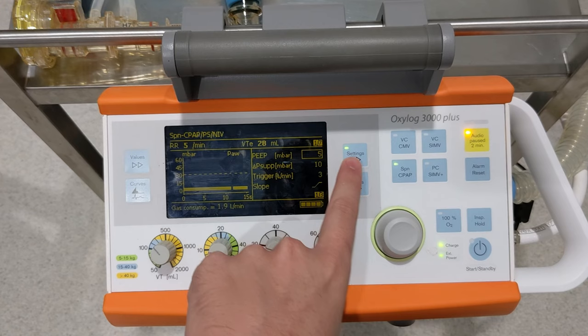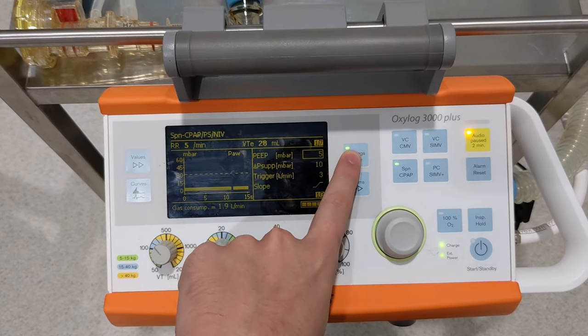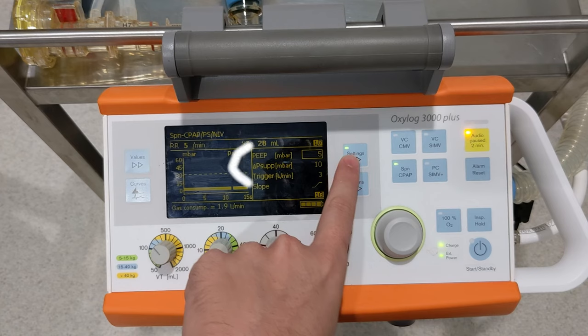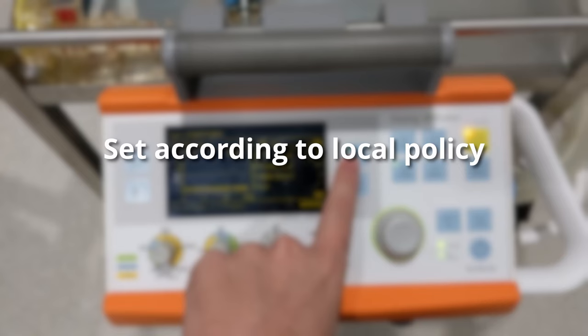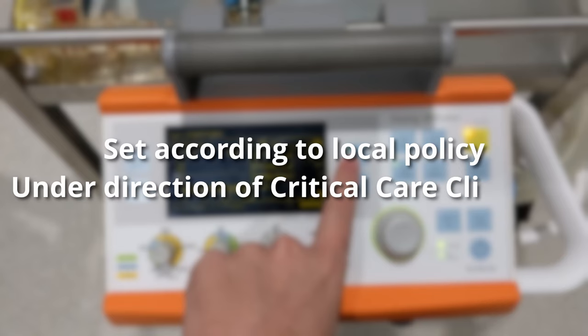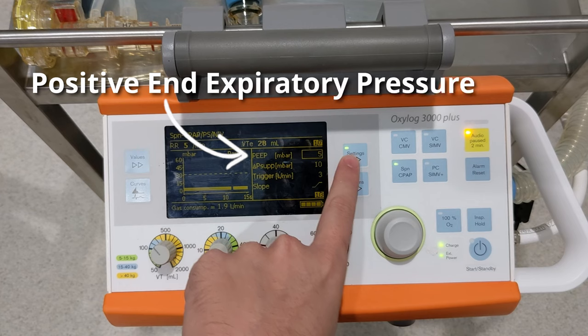The next part of setting up NIV for the OxyLog is setting the pressures that will be used to deliver oxygen to the patient. You need to go back to setting page 1 of 3, so press the setting button 2 more times. We're going to be talking about changing the positive pressure settings on the device. I won't be discussing what these values are or what they mean in relation to the patient, as that's a much deeper topic for another video. These values should always be set according to local policies at your facility and under the guidance of clinicians experienced in critical care. We'll start with PEEP, or positive end expiratory pressure. The default PEEP is 5 millibars, which is a good starting point, so just leave that for now. If you do need to change it, select it with the rotary knob, change the number, and then confirm by pressing the knob down.